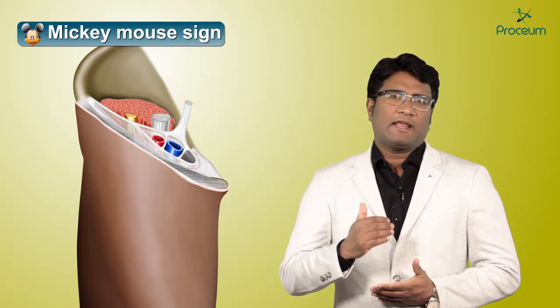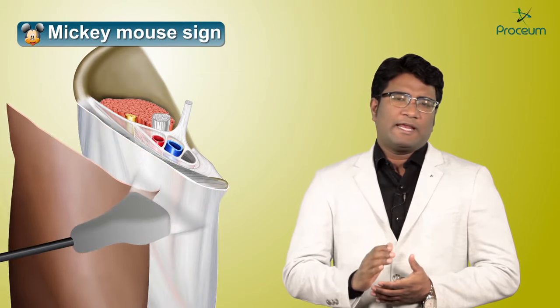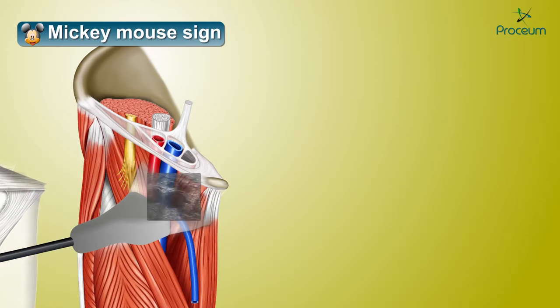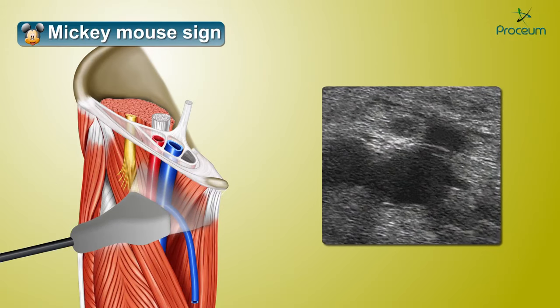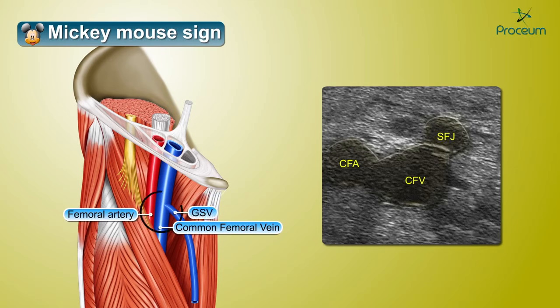The next place where we encounter the Mickey Mouse sign is at the anterior aspect of the thigh at the region of the groin. On short-axis ultrasound at the anterior aspect of the thigh at the level of the groin, the arrangement of the femoral vessels — the femoral artery, the common femoral vein, and the opening of the great saphenous vein at the saphenofemoral junction — takes the appearance of a Mickey Mouse.